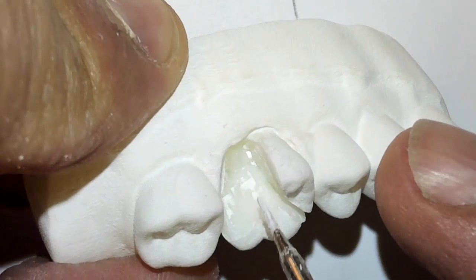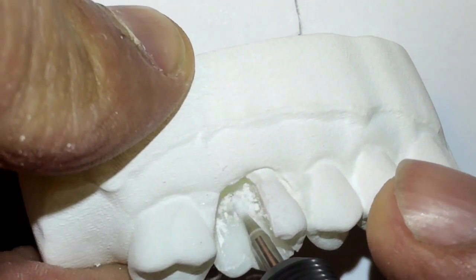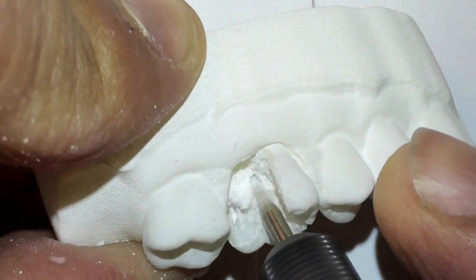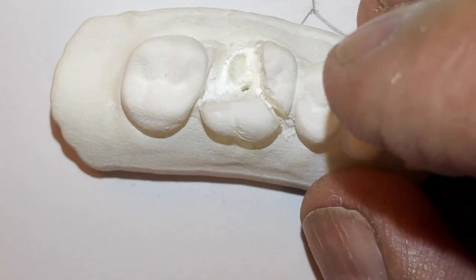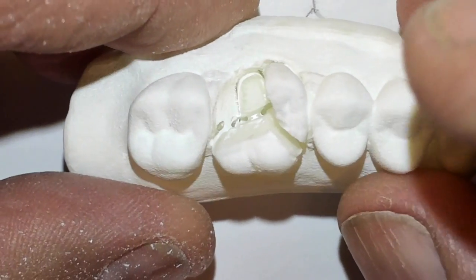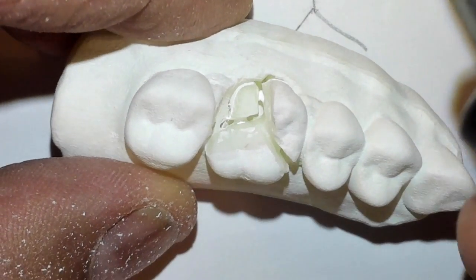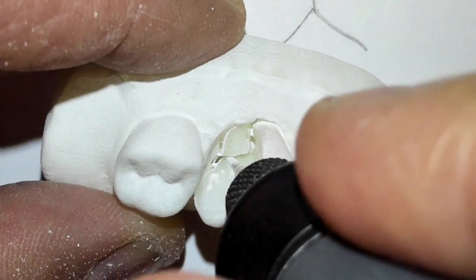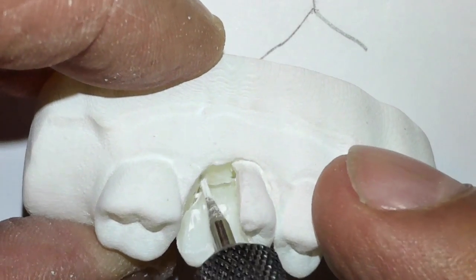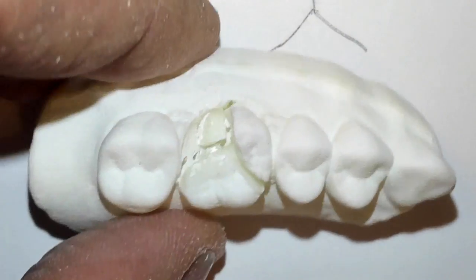Let's see if we get this distal buccal root tip out first. So going through the perc, coming up. Now in a real mouth, you have to think about the sinus — don't drill too far into the sinus. But here we're just going after root tips. There's the root tip now outlined, almost sectioned completely free. I just used my bur and you heard that click — now it's loose. We can get that out, but it's going to take a little bit. Perhaps we can get it out, but in real life it's a little difficult.